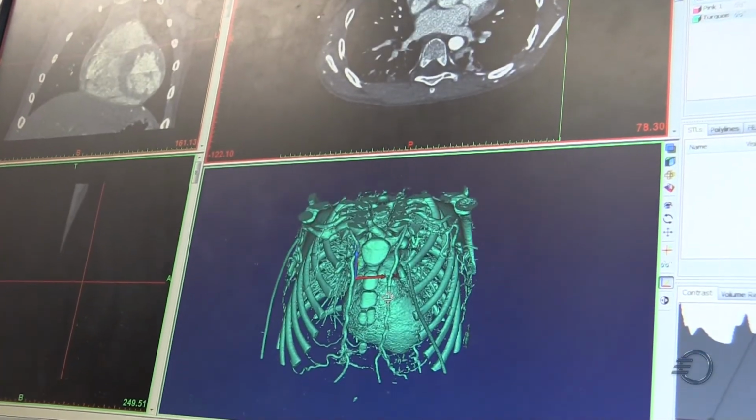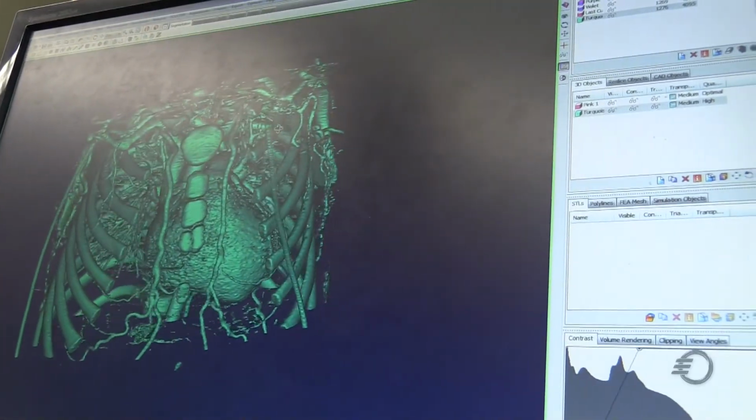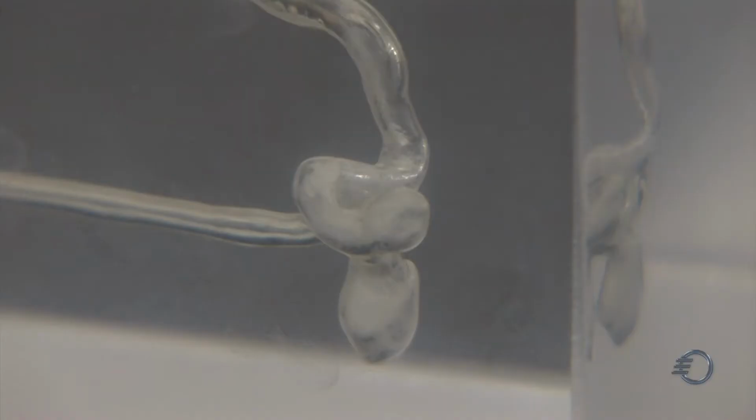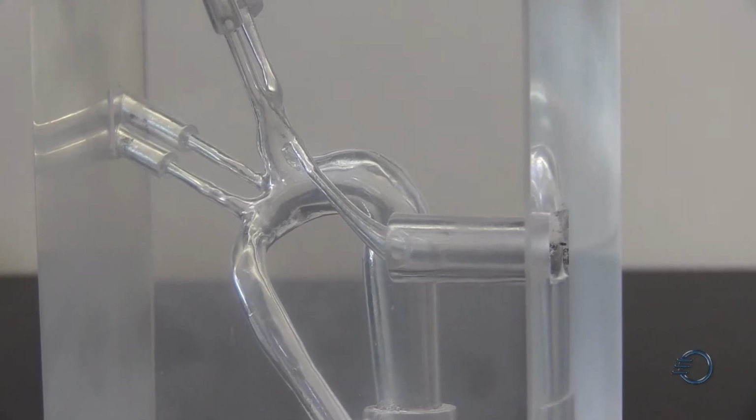Right now we're in an emergent environment. There's a patient that has some type of malformation in their anatomy, some type of disease of a structure. We can visualize that based off CT images. We can reconstruct in the computer and then 3D print it. So a doctor can actually hold a patient's anatomy in their hand before he or she ever operates on a patient. That is not just delivering a promise of 3D printing, but it's changing the entire architecture of what medicine is.